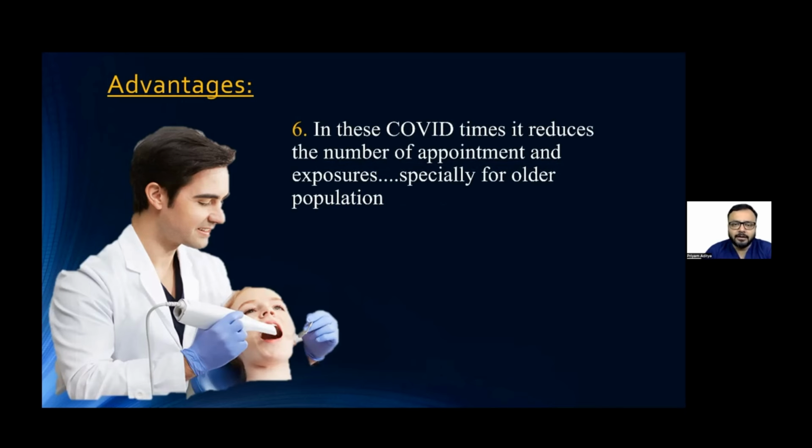COVID times have been disturbing all over the world, all over the countries, and patients are now very aware of infections and cross contaminations. Especially in older patients, sometimes the patients do not want to come many times because they feel that they're getting more exposed and have a higher chance of getting any kind of infection. So in those patients, you can scan and you can sometimes reduce the treatment time for them. Especially if you're doing dentures for your old patients, you can actually keep a scanned copy of your dentures. And if the patient happens to break the denture, you can just duplicate that denture and print a denture and send it back to them at their homes without them coming to your clinic. So that's a big plus for an intraoral scanner.